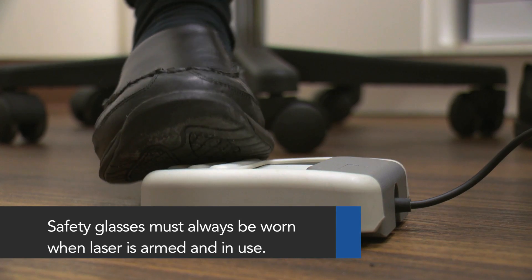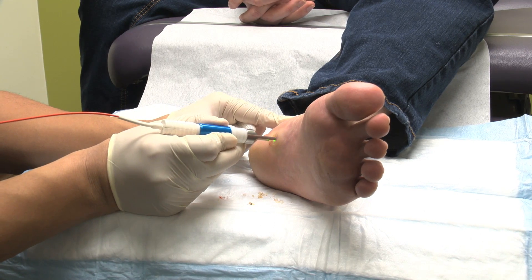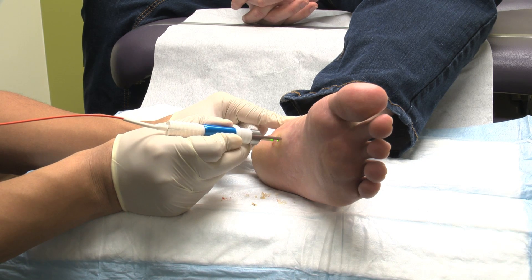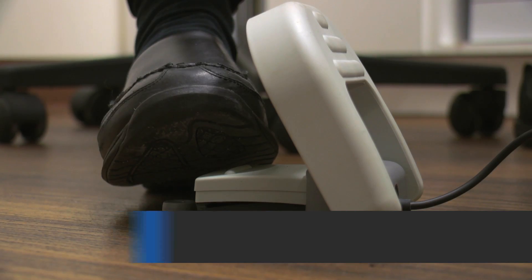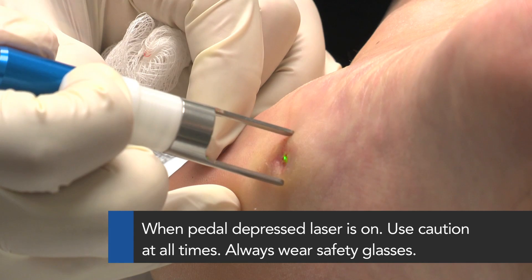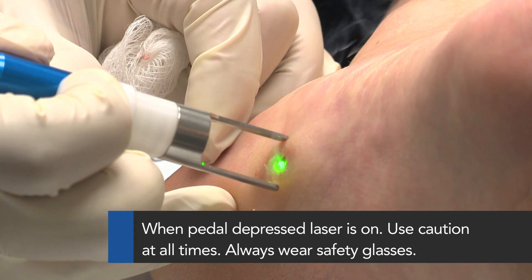Next, open the safety cover on the foot pedal. Make sure the handpiece metal spacer is touching the patient's skin and the green aiming beam is pointing to the target area. Depress the foot pedal to turn the laser on. Make sure the handpiece and indicator are pointed at the treatment area.